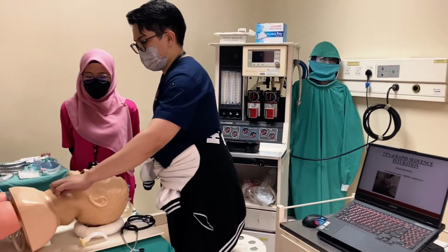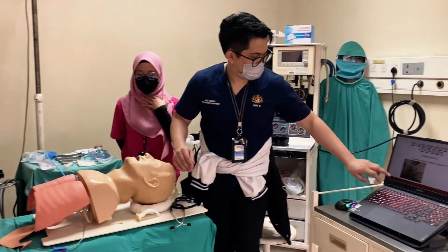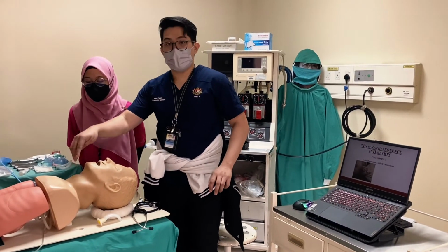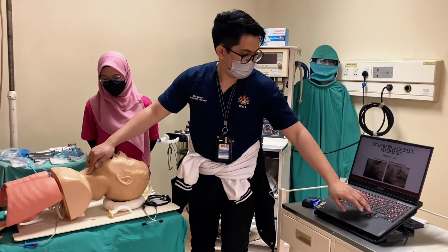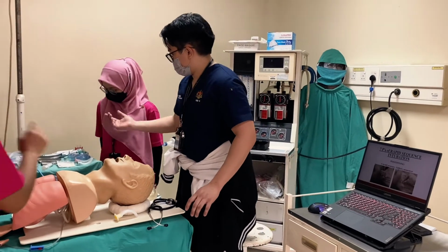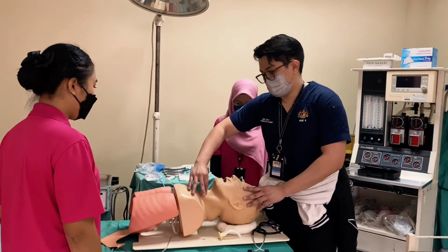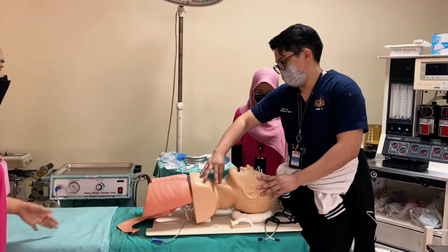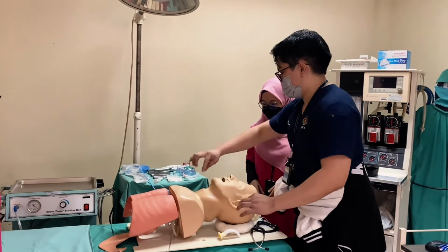First, we find the landmark. From this landmark, as you can see from here, this is the cricoid cartilage. We will ask our assistant to provide cricoid pressure. So we ask him, from this level, to compress, to do the cricoid pressure or Sellick maneuver. You can do it from here. It's okay. No, here, on this side, do this with one hand.